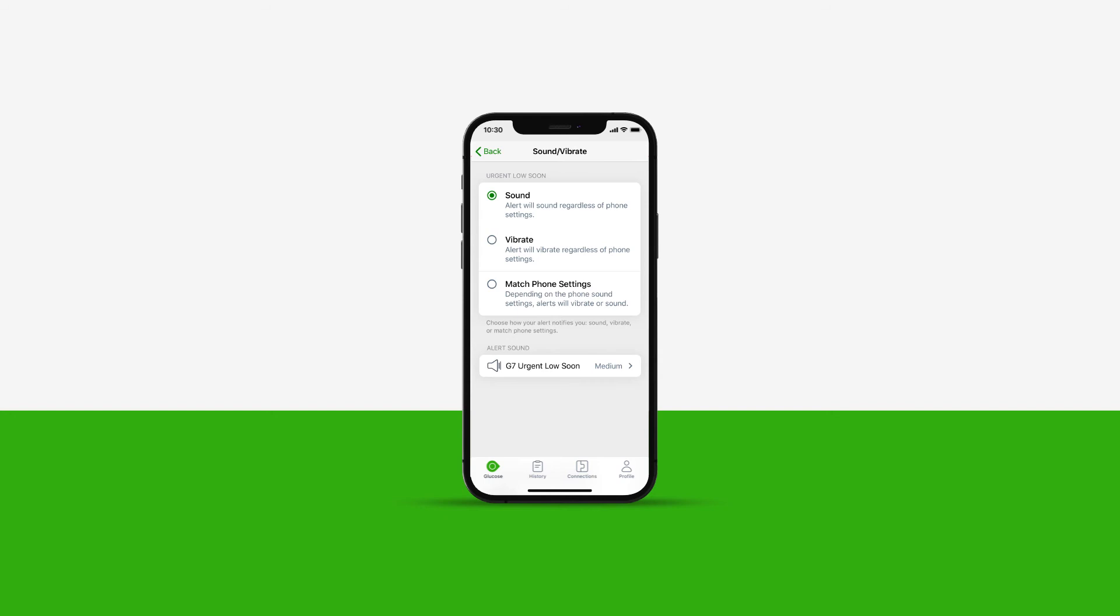There is a fixed snooze alert. After you acknowledge your first alert, it repeats every 30 minutes if your sensor reading stays in the urgent low soon state for this long. This setting can't be changed.